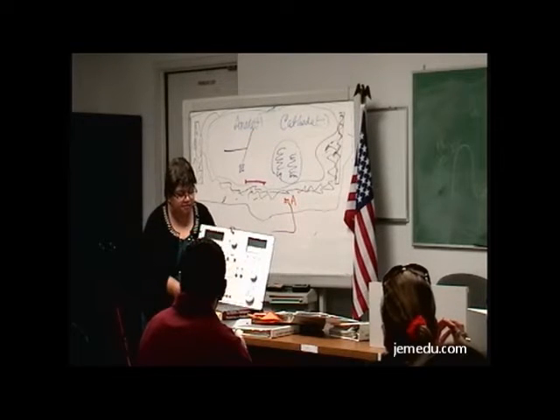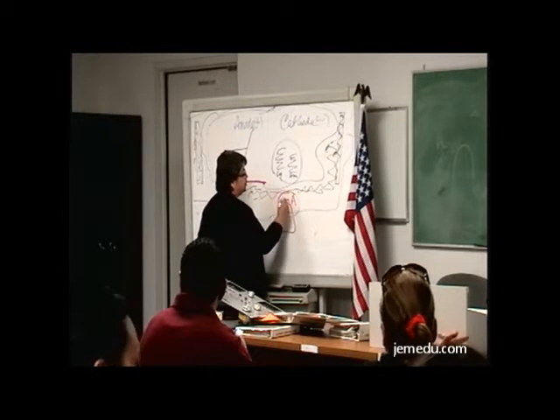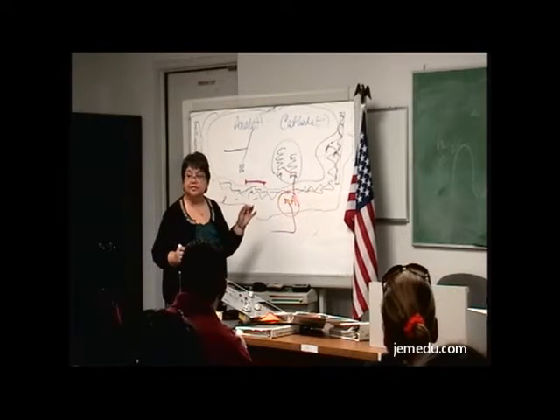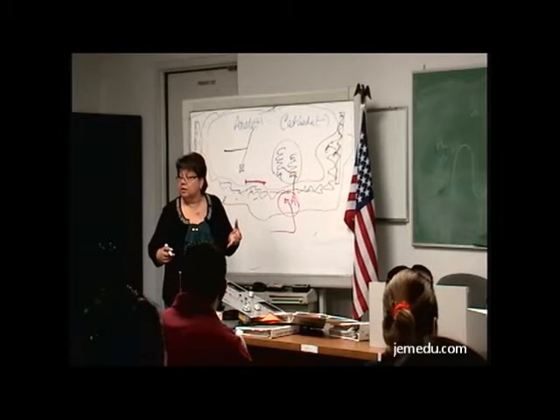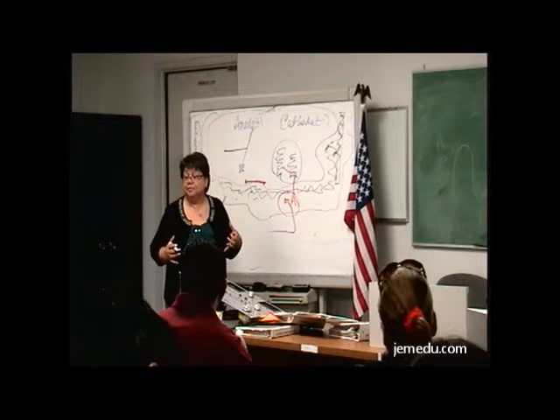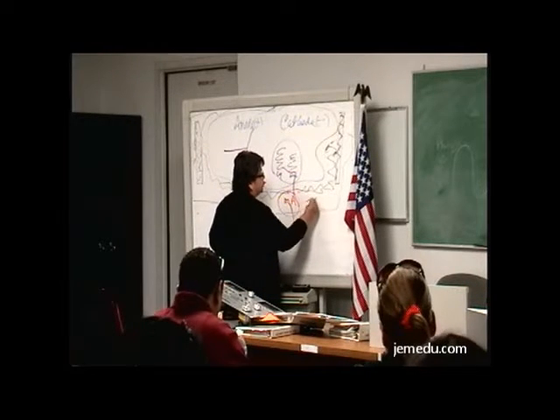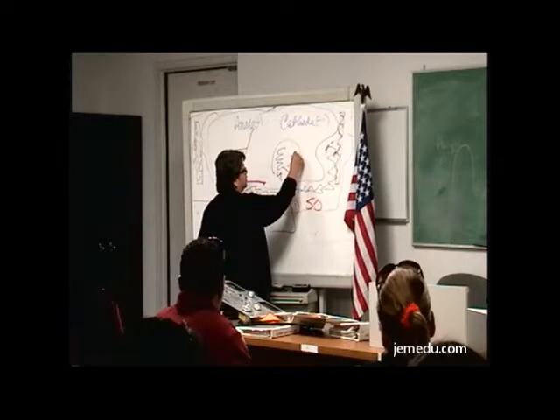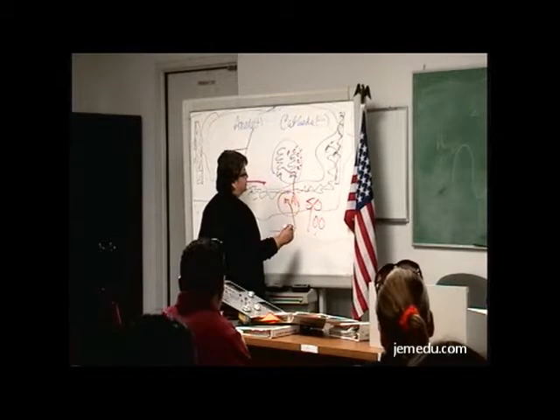So when you're selecting those milliampere stations, we're going to select which filament we're going to use, but also how hot this is going to get. It's almost like the thermostat on a heater. The higher number you pick, the more electrons you're going to get. But you can't get electrons unless you have what? For the milliamperage? Heat. So these are going to get hot. So if I picked 50 mA, and I'm going to the small, I'm going to start producing electrons, correct? If I went to 100, would I get more electrons or less? More.